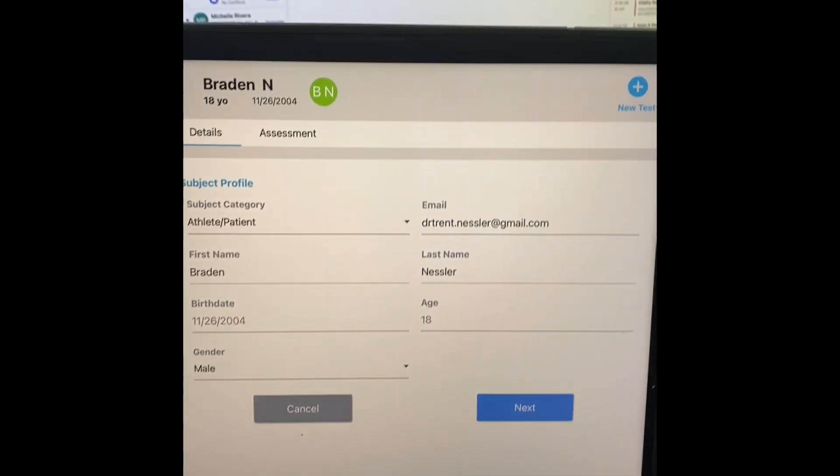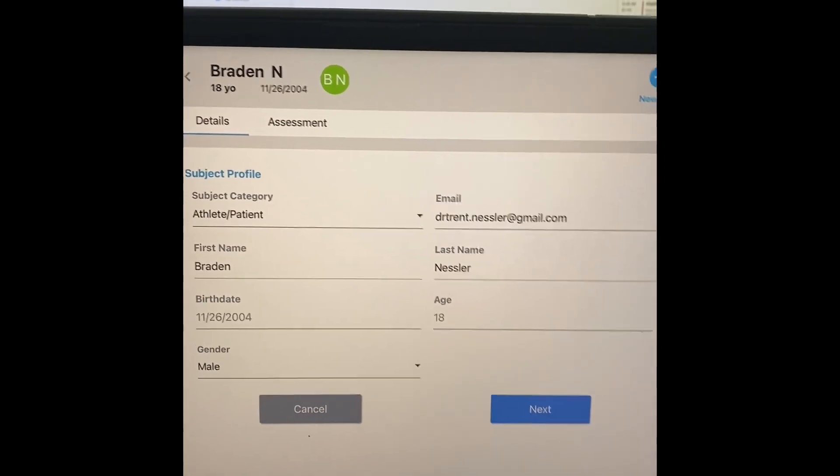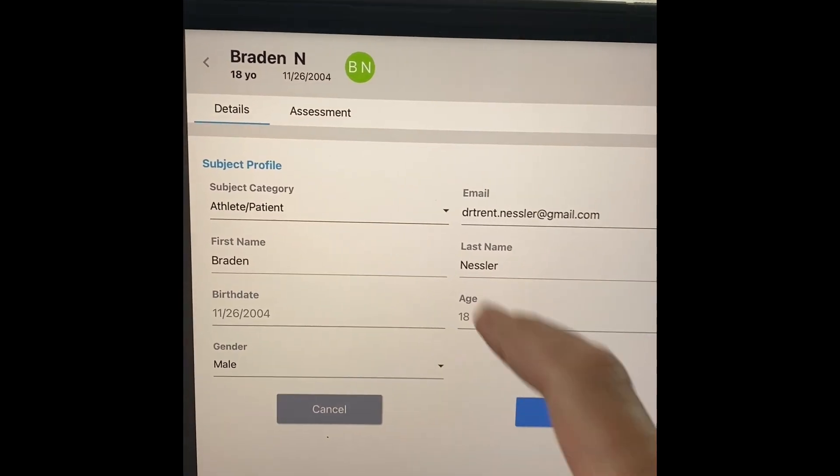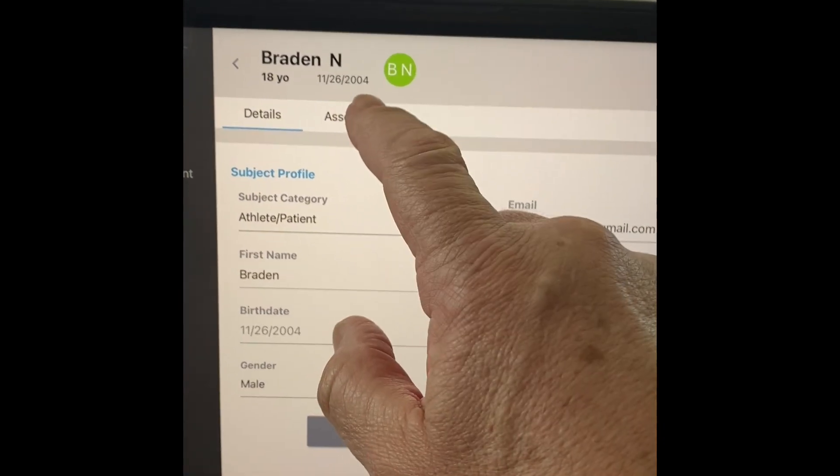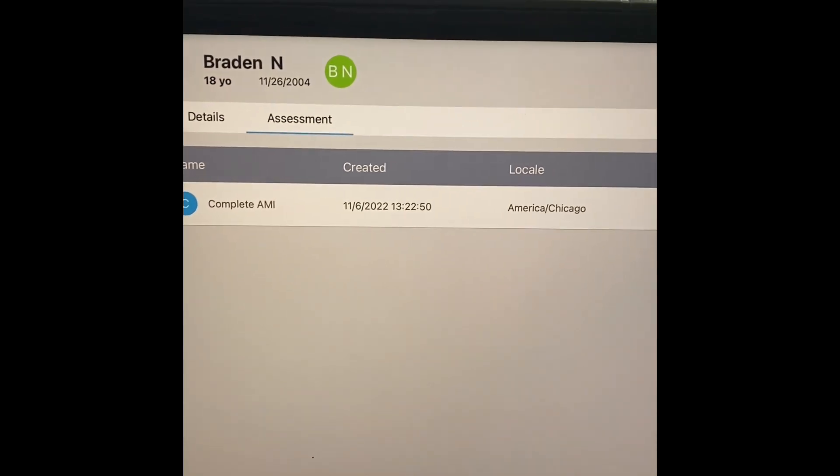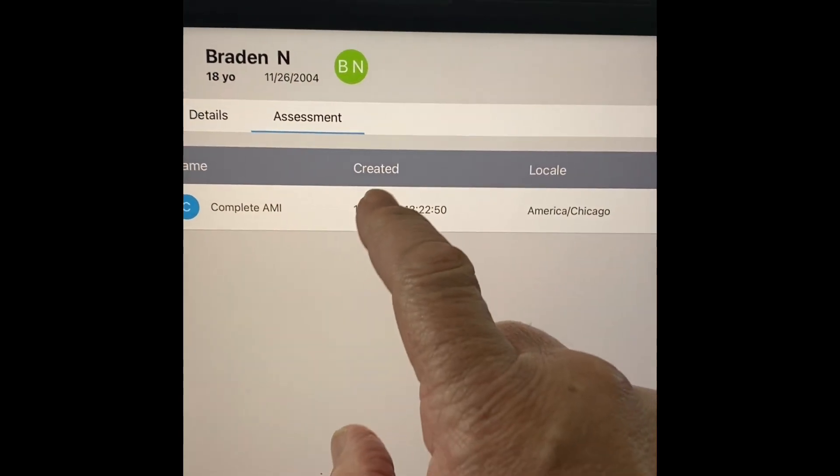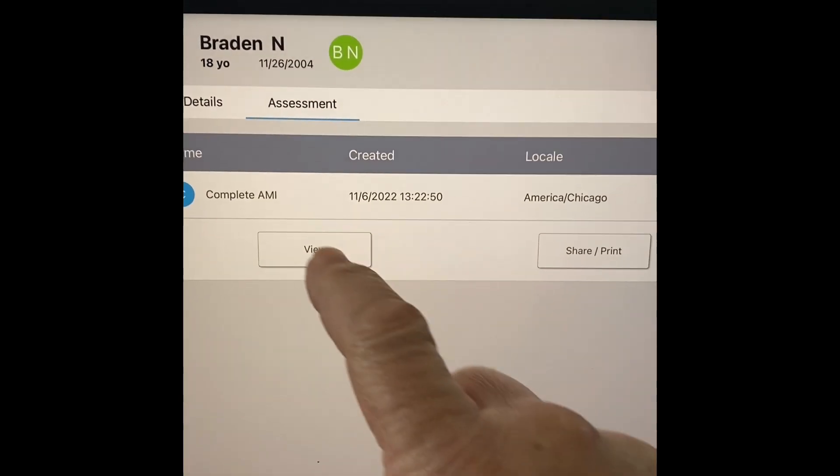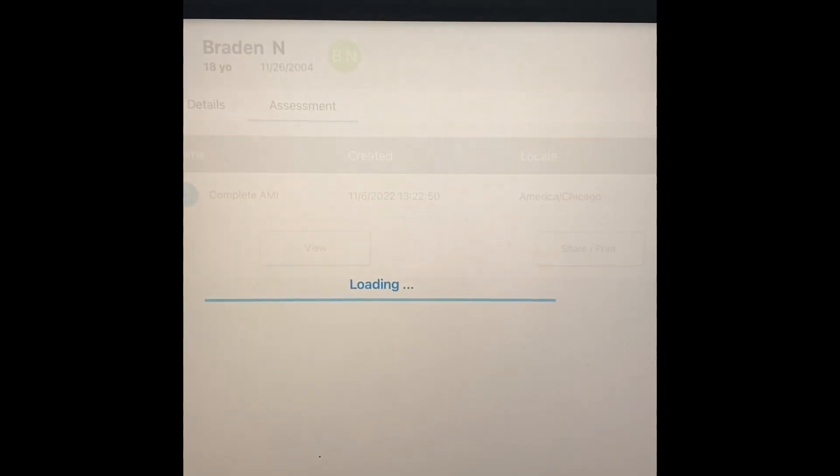He's 18 now. And what I want to share with you is what his actual assessment looks like. So I'm going up to this assessment page. I'm going to click on the assessment. I go to view.